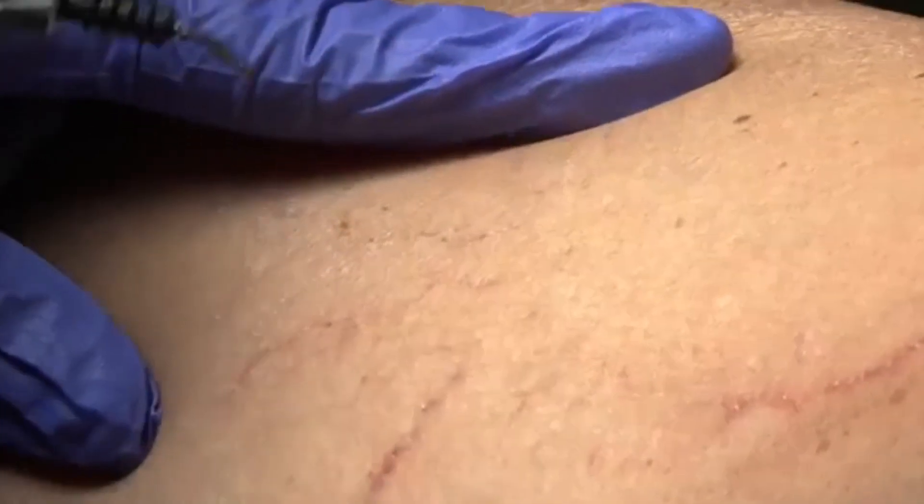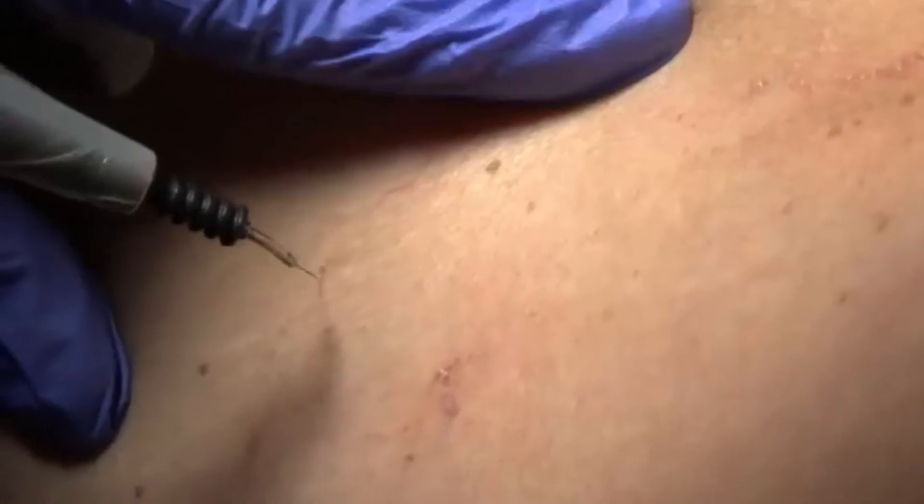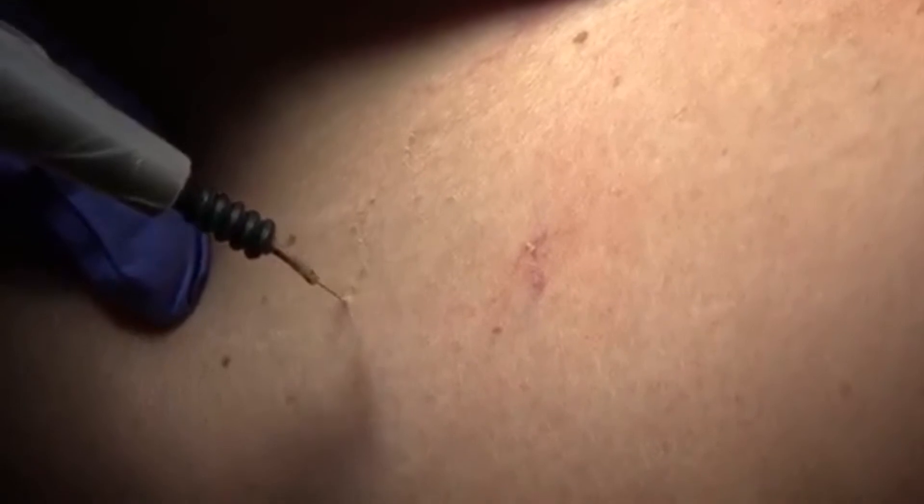The ARIN 940 offers power output control down to one-tenth of a watt, also making it ideal for facial telangiectasias. It is easy to make accurate minor adjustments and minimize potential scarring.